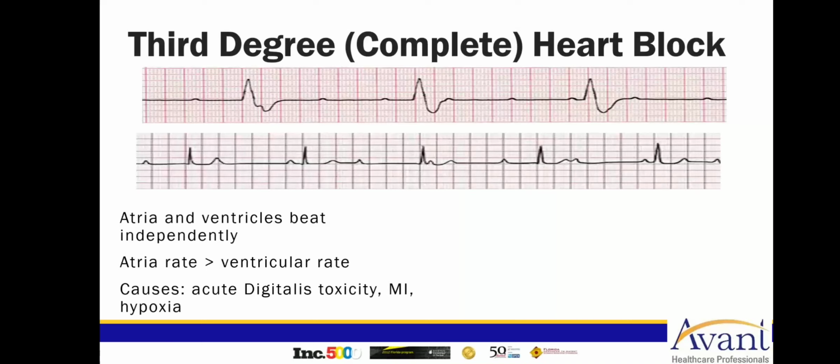But just for your own understanding, there is what we call a complete heart block at the bundle branch level, meaning the bundle branches are creating the ventricular beat. The second example here, again, is still complete heart block because the PR intervals are all over the place. They're separated from the ventricle, but this is a complete heart block AV nodal level or AV level block. I know, you're thinking, crazy, isn't it? The idea is that you have to look at the PR interval and you have a varying PR interval in both these examples, so they are both complete heart blocks.